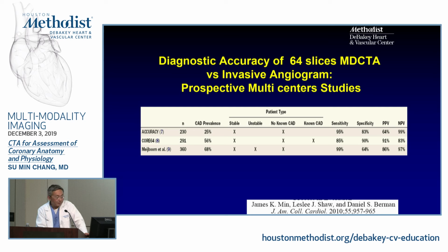But regardless, the key here is if you have a normal or minimal disease in the coronary CTA, most likely you will not have significant coronary stenosis. That's really the major strength of CT, okay?